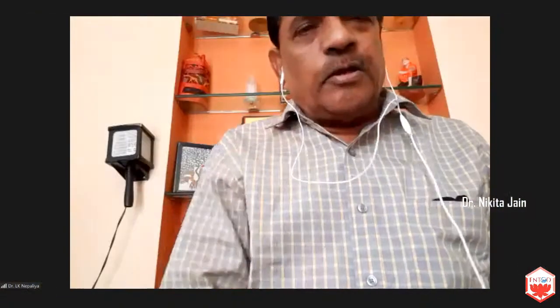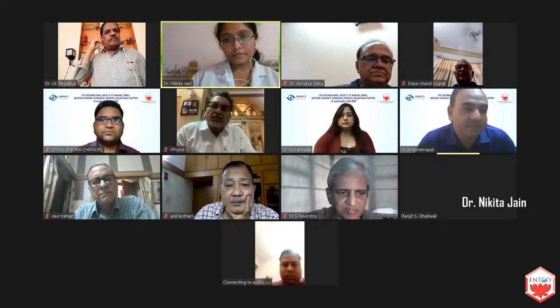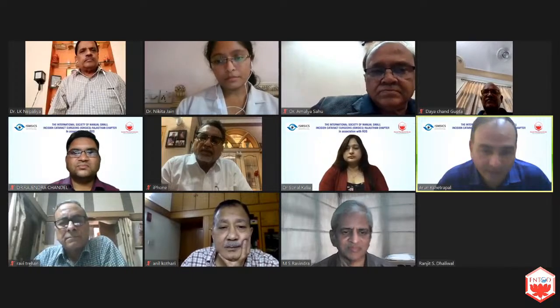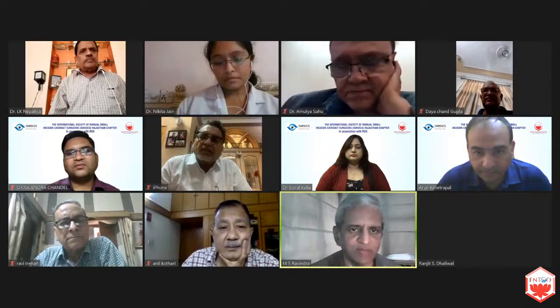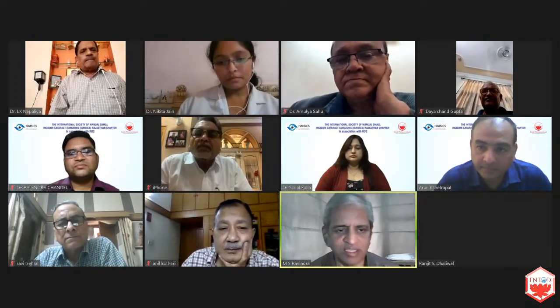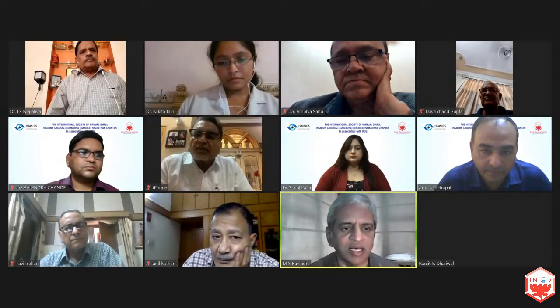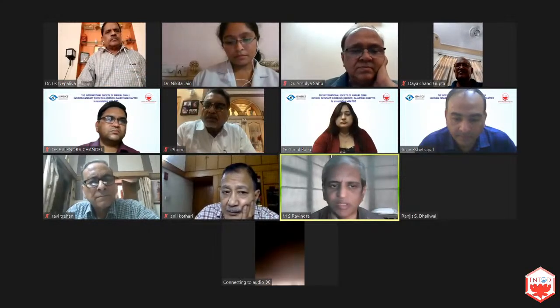Dr. Nikita, you are talking about anterior iris claw implants or posterior iris claw implants? So for posterior. Retropupillary iris claw. Retrofixation of the iris claw. Yes, sir. Dr. Ravindran is a master in this and I have learned this technique from him. Can you elaborate more, sir, Dr. Ravindran? It basically depends upon the constant of the lens. And as Dr. Jain said, it's very relevant. Most of the iris claw lens mention the anterior iris claw fixation A constant. So that's not correct.